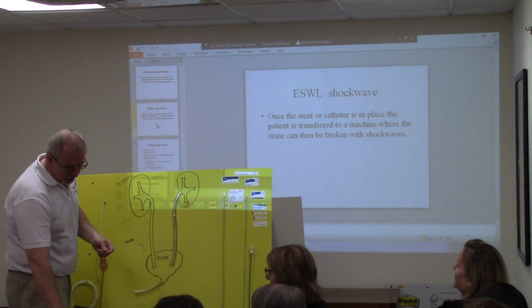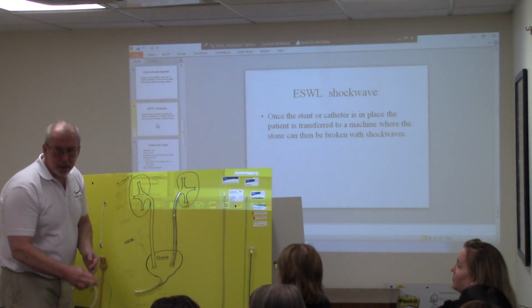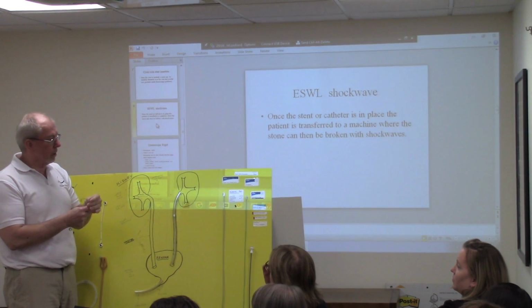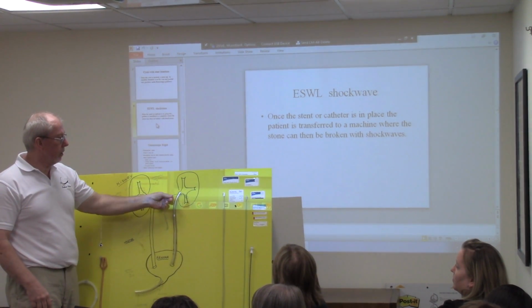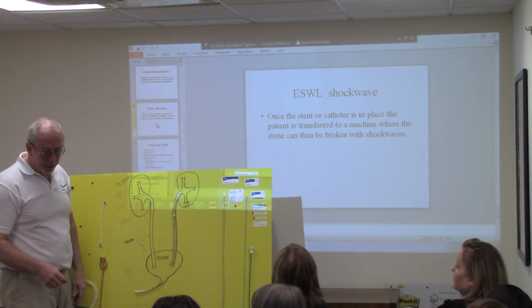And the guide wire is what keeps it straight to get it all the way up there. Correct. And then when you pull the guide wire out, it curls up. Correct. Yeah, as soon as you pull it out, it curls, and it should be in position. Usually use x-ray to make sure that it's sitting in there in the proper way.